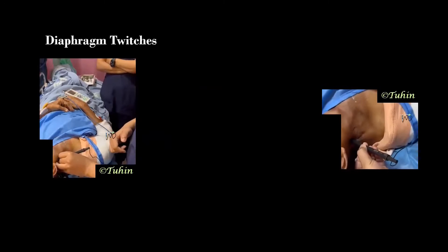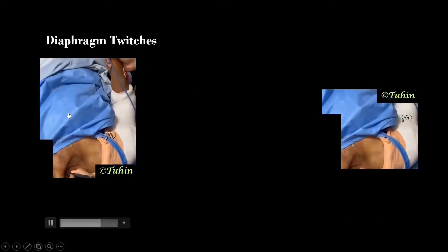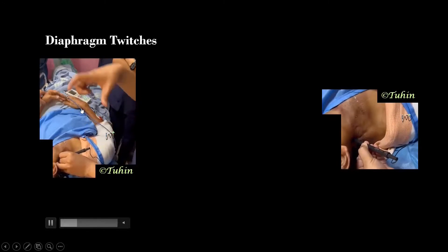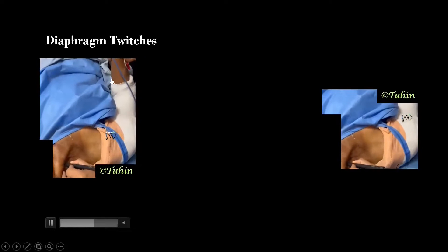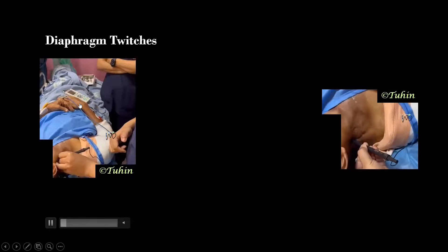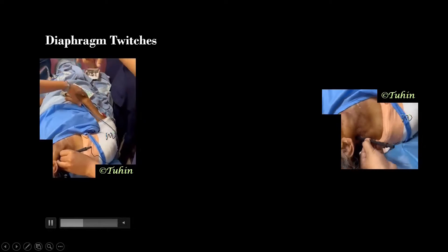Twitches of the diaphragm indicate stimulation of the phrenic nerve, meaning the needle is inserted too anteriorly and medially. We have to withdraw the needle and reinsert 15 degrees more posterior and lateral. The contraction of the diaphragm can create a pseudo-response of the upper limb — this is the reason why you should keep the upper limb away from the lower thoracic or upper abdominal region.